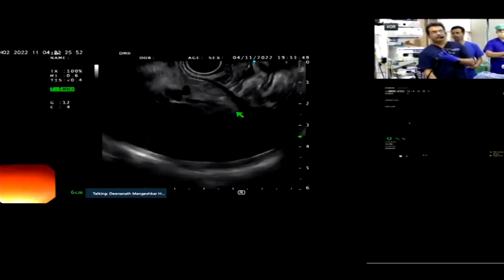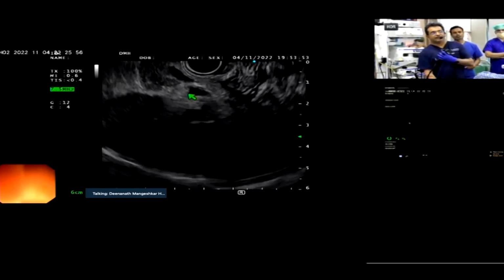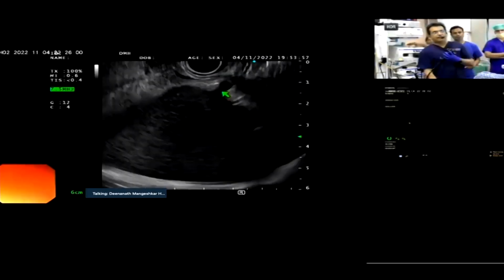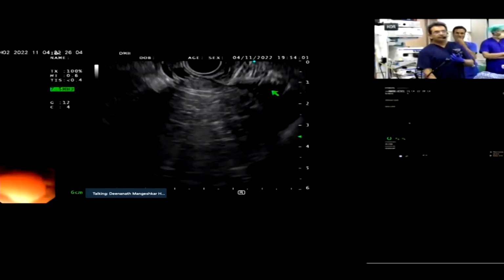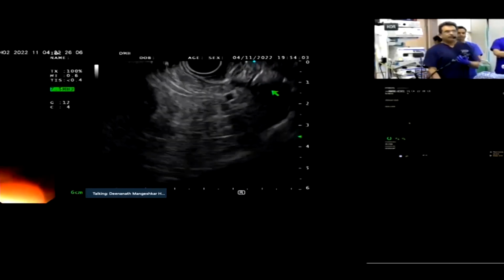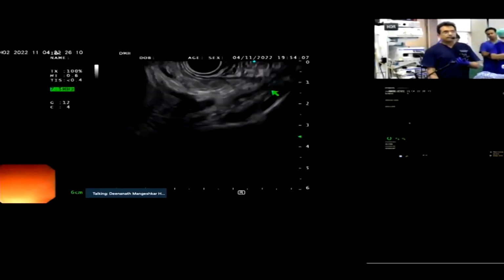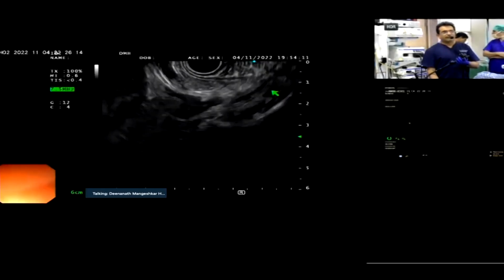That's the spleen. And that is the splenic hilum, and that is the tail of the pancreas. You can see at around 11 o'clock over there with the splenic hilum. And as I rotate backwards again, I can also see very often the suprarenal. That is the suprarenal over there, the bird shaped suprarenal. You can see the left adrenal gland.